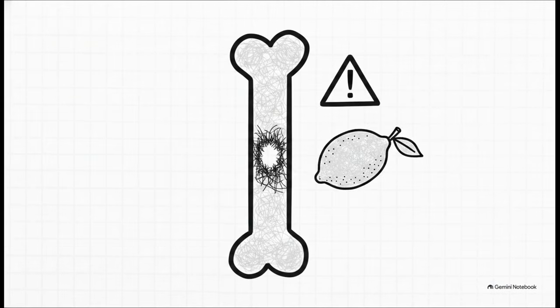Let's backtrack to Step 1 for a second. When a hole just opens up right in the middle of the bone shaft, this can be genuinely terrifying because these aggressive round cell lytic lesions often totally mimic each other. And that is exactly where you deploy the LEMON mnemonic. Leukemia and lymphoma, eosinophilic granuloma and Ewing tumor, multiple myeloma, osteomyelitis, which, tricky enough, mimics a tumor, and neuroblastoma metastasis.